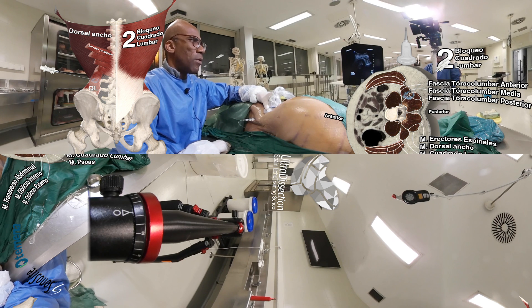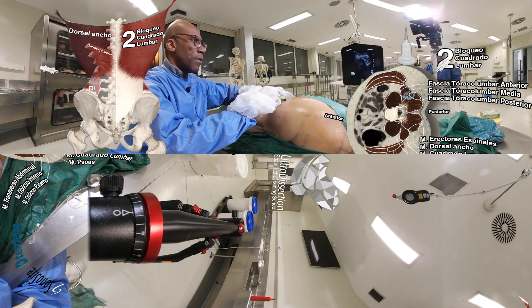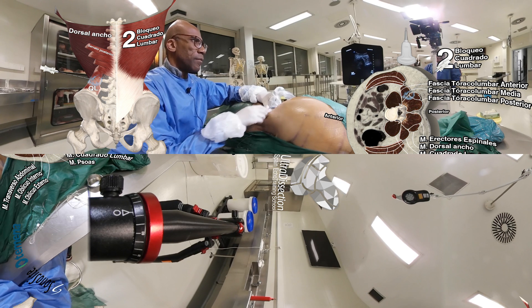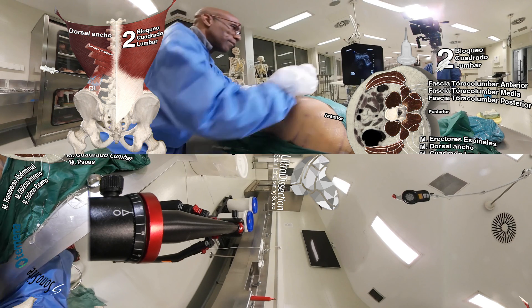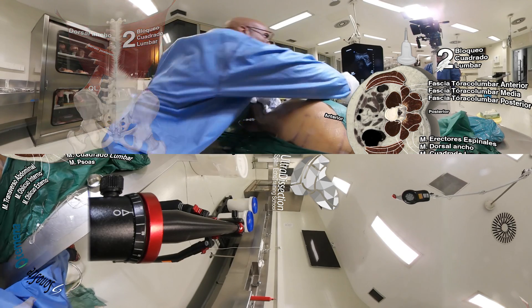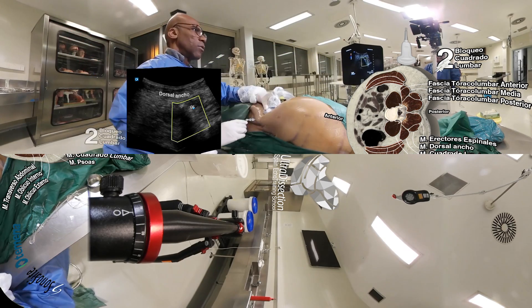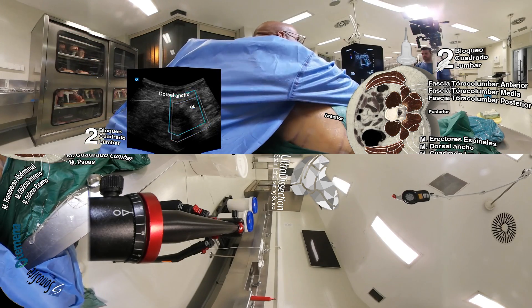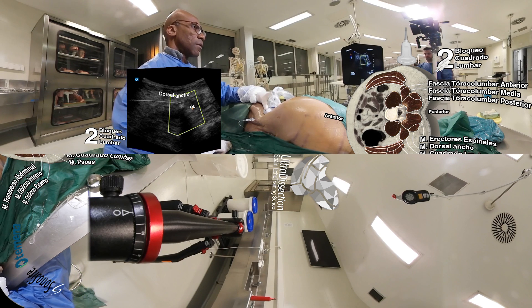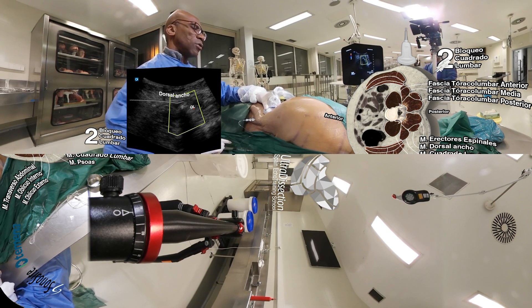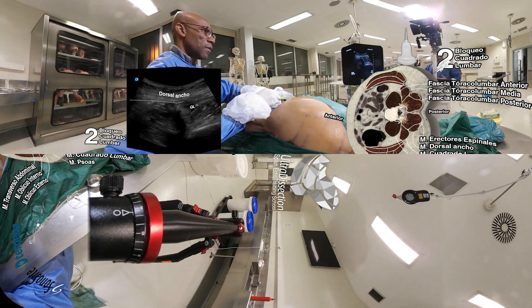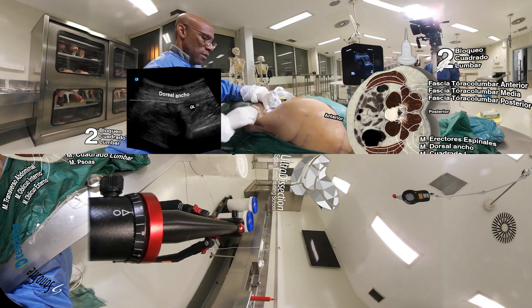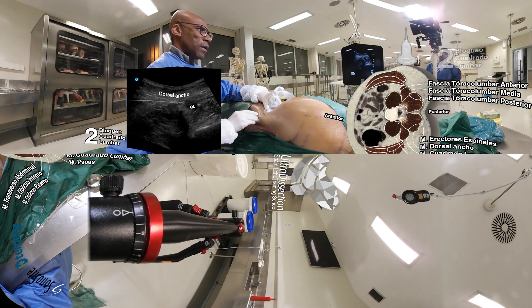We see the diffusion. We apply double color to visualize the diffusion of the local anesthetic. That is the diffusion — we can observe it clearly spreading here.